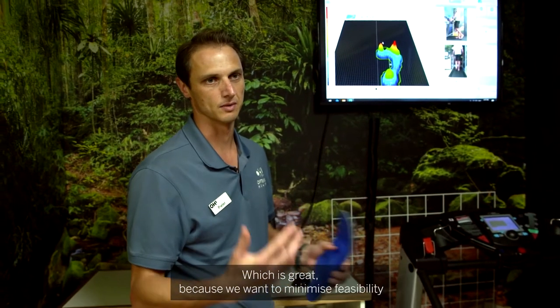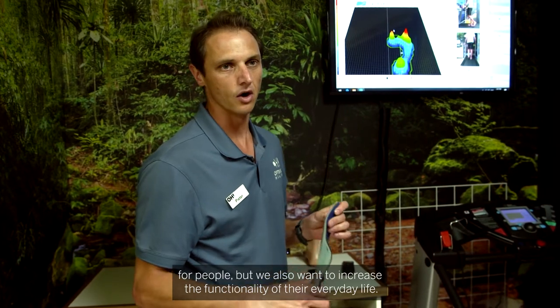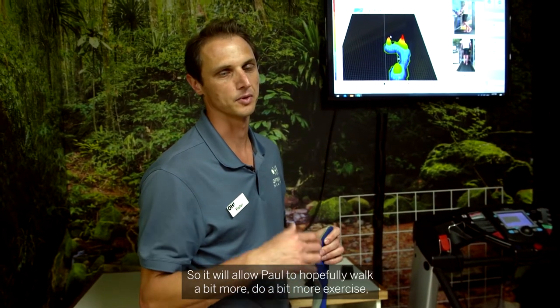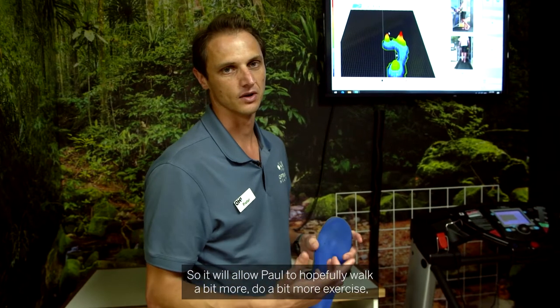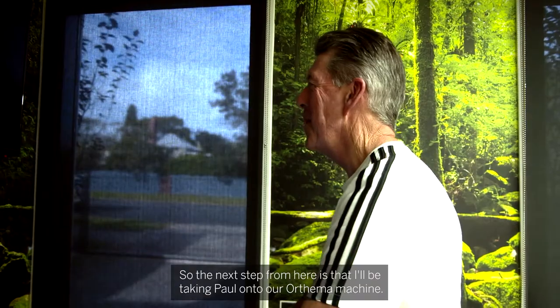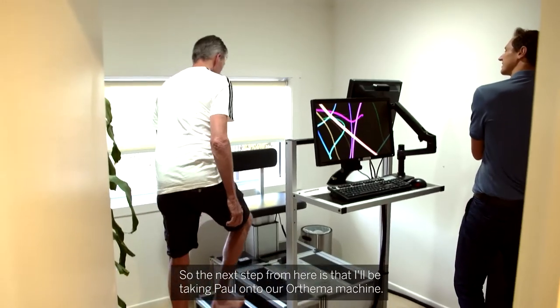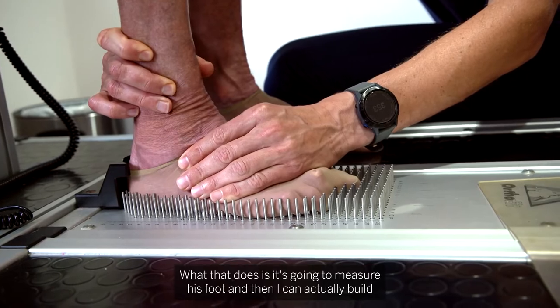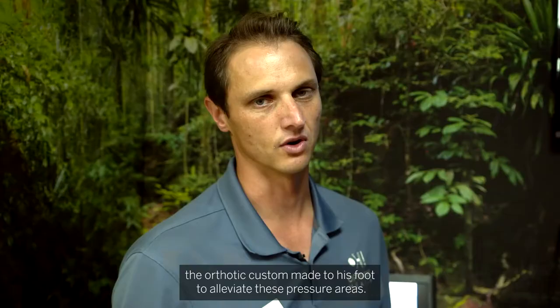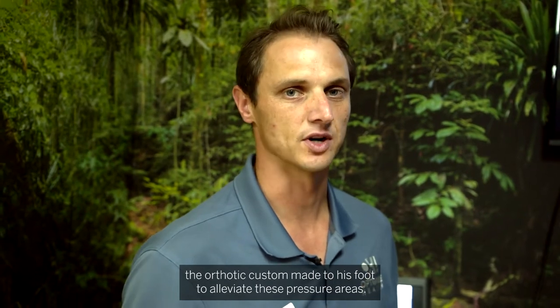We want to minimise visits for people but also increase the functionality of their everyday life. We'll allow Paul to hopefully walk a bit more, do a bit more exercise, and not develop a chronic metatarsal injury that stops him from doing the things that he loves. The next step is that I'll be taking Paul onto our Orthema machine, which will measure his foot so I can build the orthotic custom made to his foot to alleviate these pressure areas.